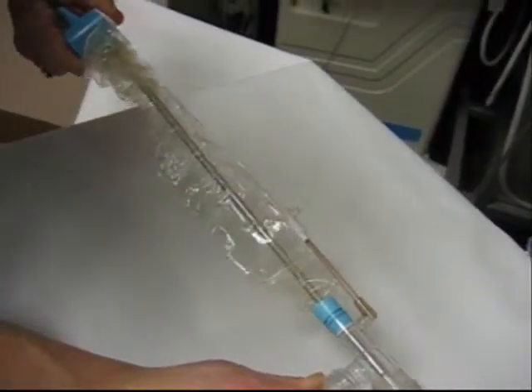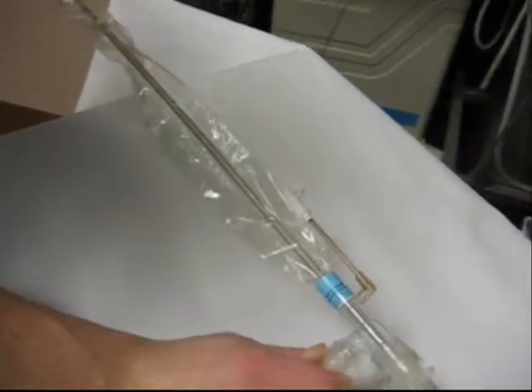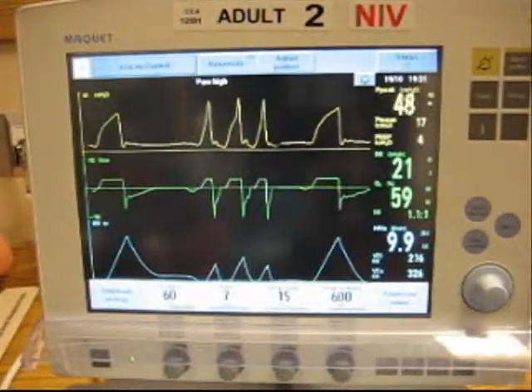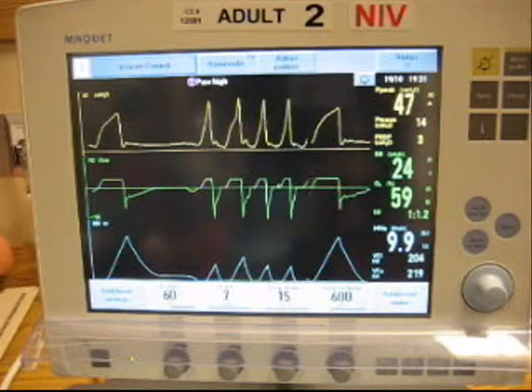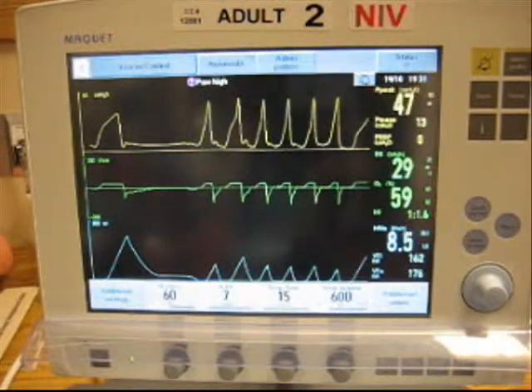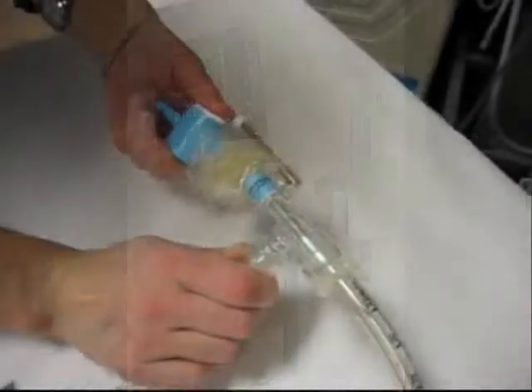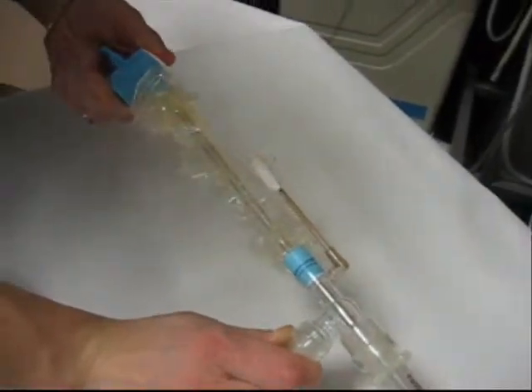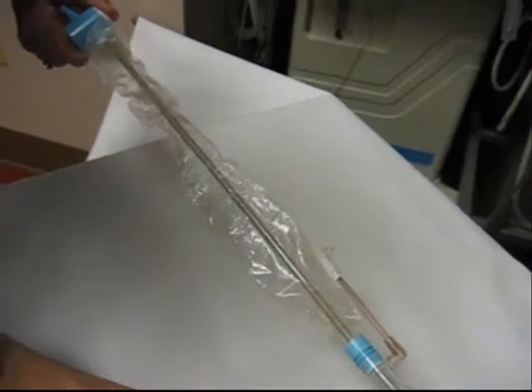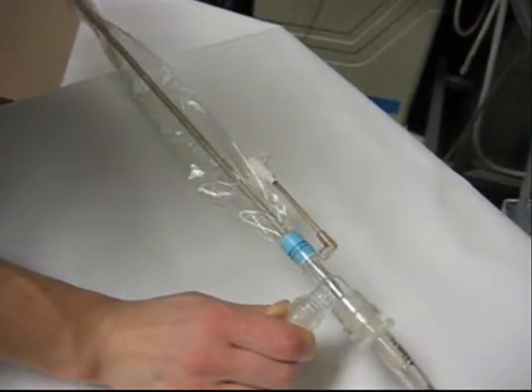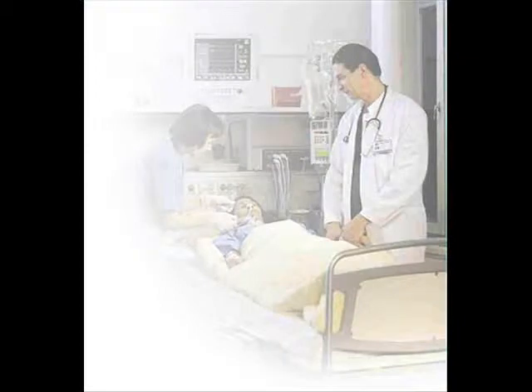Insert the catheter and then gently withdraw the catheter applying suction as you withdraw. Monitor the patient during the procedure on both the ventilator and the bedside monitor. Repeat as needed based upon your prior assessment.